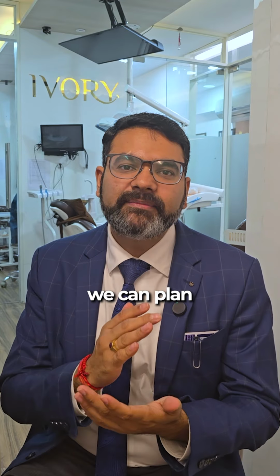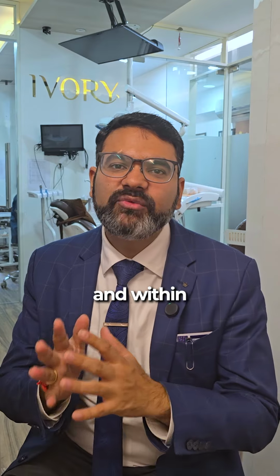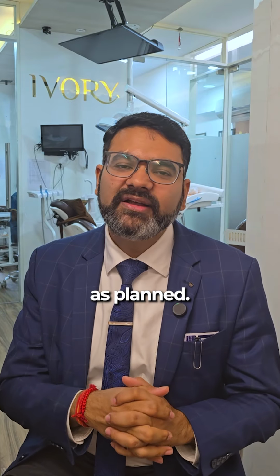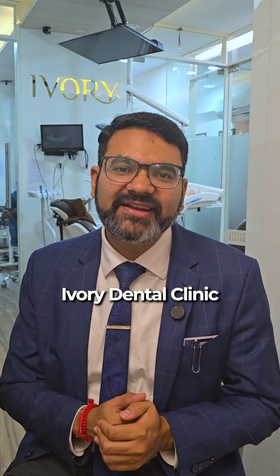Before the extraction, we can plan what is the size of the implant, what is the angle. Then we can do the surgery, and within 1 hour, we took the CBCT scan again to verify whether we have placed it correctly as planned. So we can see it is perfectly placed, and that's how technology helps at Ivory Dental Clinic for the betterment of our patients.